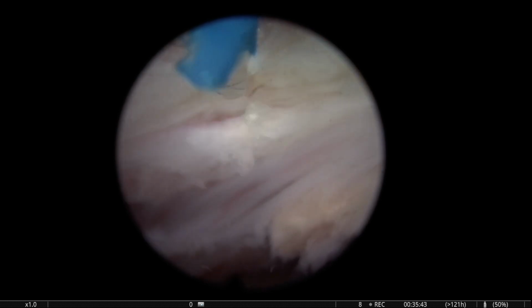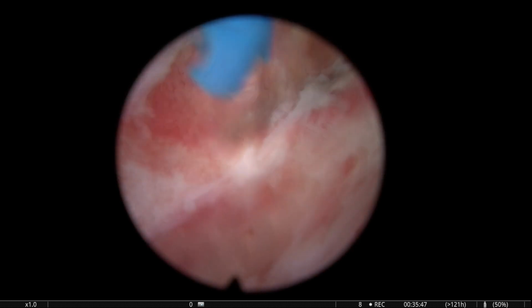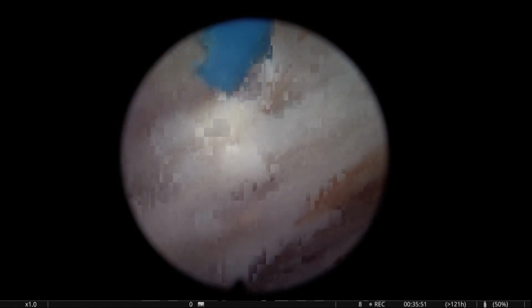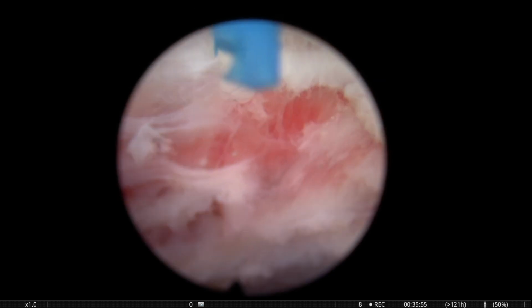Here I'm using different settings, although I coagulate sometimes with the same 2 joules 50 hertz setting with virtual basket, just by separating the fiber a little bit more.